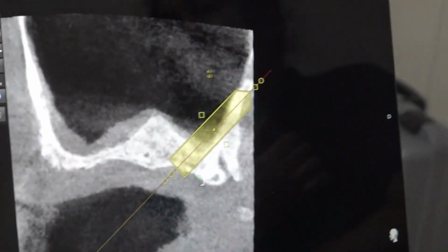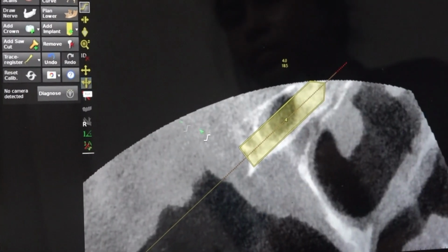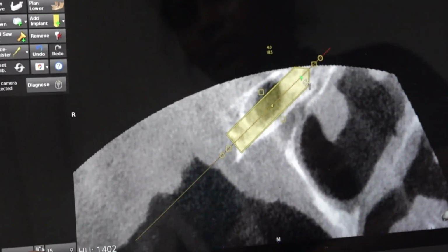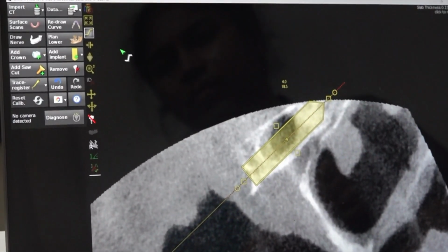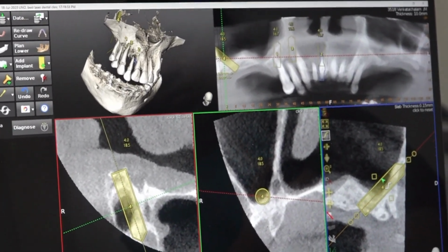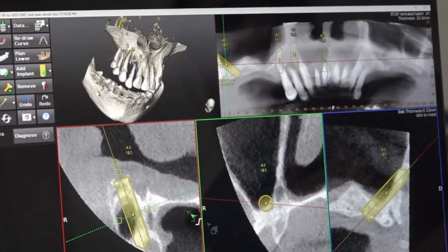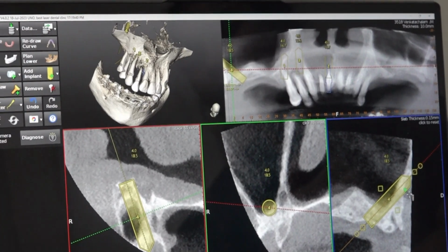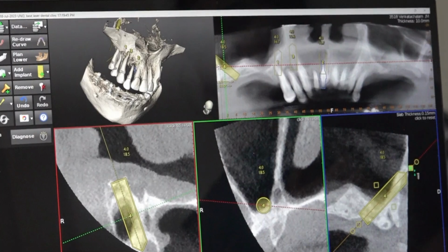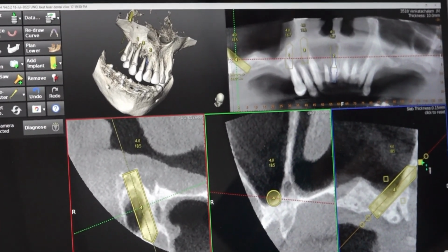Okay. We'll see the 360 degree. Okay. See, now you are crossing the sinus and you are going into the pterygoid. See the pterygoid, 1400. It is good only. So there is one more technique we can use, you can even use a compressive implant. Even though you are crossing the sinus, nothing will happen. Only a few millimeters will cross the sinus. If you use a compressive implant, it is easy to catch the osteotomy on the other side. But this system doesn't have 18 mm and so on. It has only 15 mm, which is a big drawback. Okay.